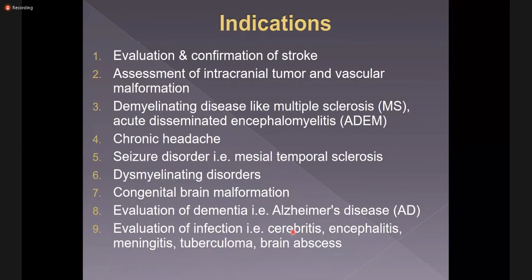In these cases, MR has very good resolution. But if MR is not available, then we should go to the CT. Or if there is a contraindication for the MRI, then we go for the CT scan.